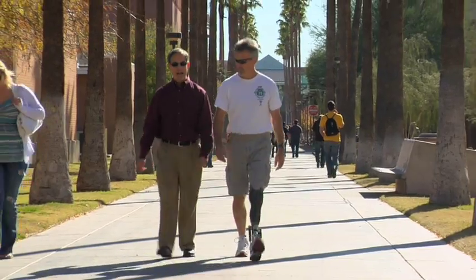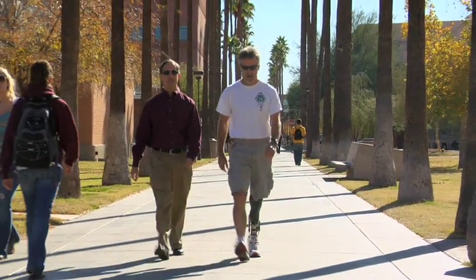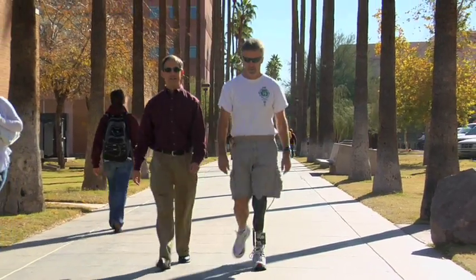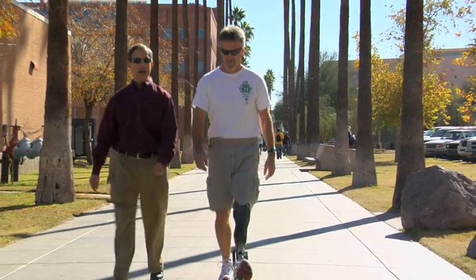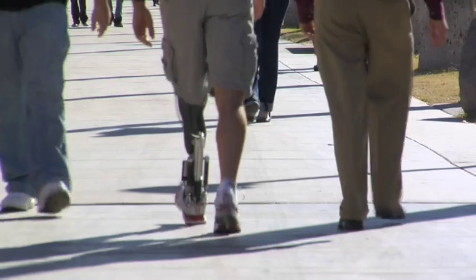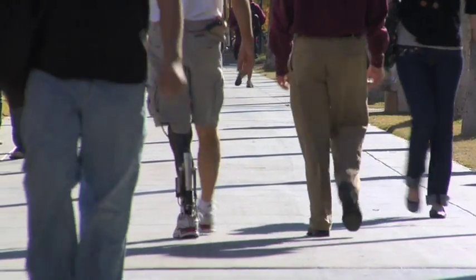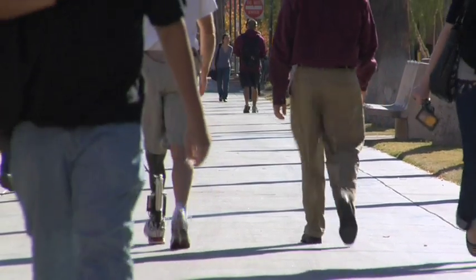The biggest thing is watching these guys' faces — they don't expect it to work because prosthetics haven't been so great. They put it on skeptical, but within two minutes they get used to it and they don't want to take it off. Since I lost my leg I've dreamt for so long of being able to walk normally again, and this really gives me that feeling — the one I dream about. It's just a smooth gait. It feels very, very normal.